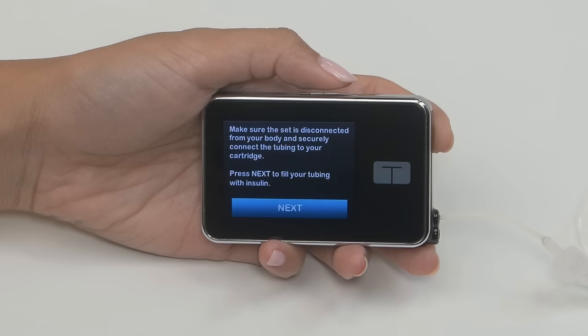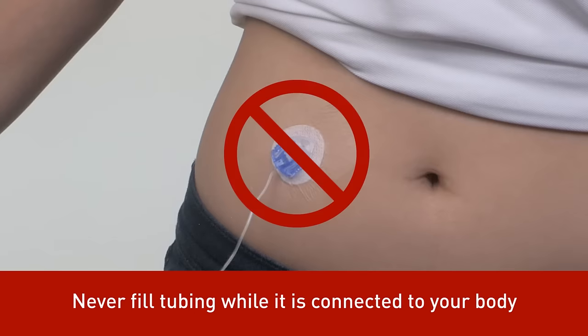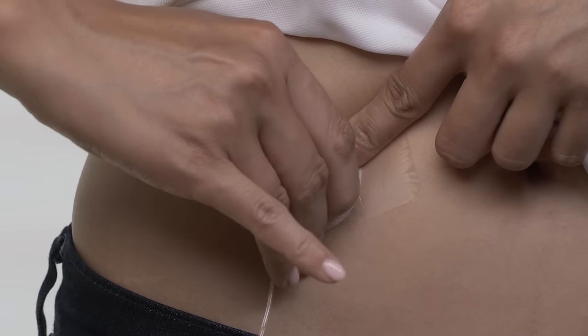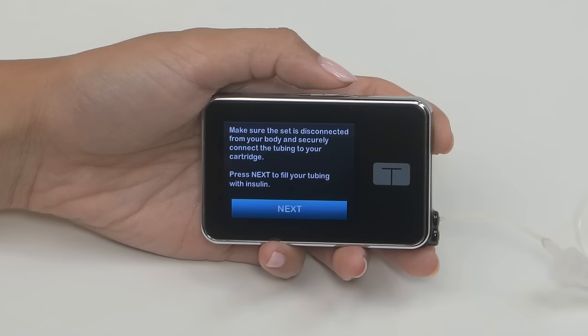Next, your pump will prompt you to fill your tubing with insulin. Never ever fill your tubing when it's connected to your body. This could result in the unintended delivery of insulin. Always disconnect your infusion set from your body before you begin a load sequence. Your pump will remind you of this each time you tap load.